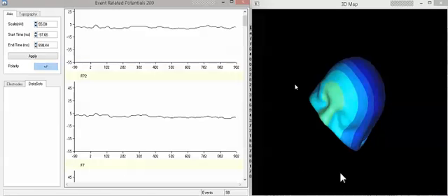This is the part where it's called topographies. You can have as many as 10 different heads in the future. And you can select different latencies of the evoked potential to look at the electrical potential and different perspectives.